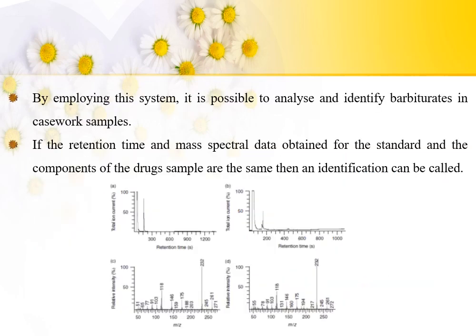by employing this system, it is possible to analyze and identify barbiturates in the casework samples or the seized samples. If the retention time and the mass spectral data obtained for the standard and the components of the drug sample are the same, then an identification can be called and barbiturates will be confirmed in the obtained sample.